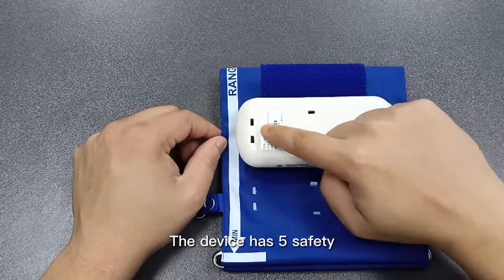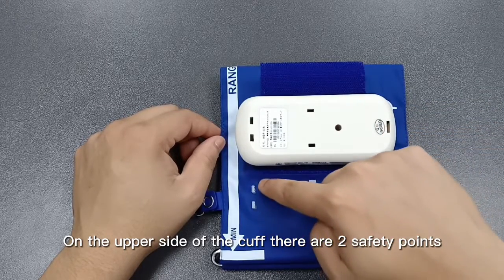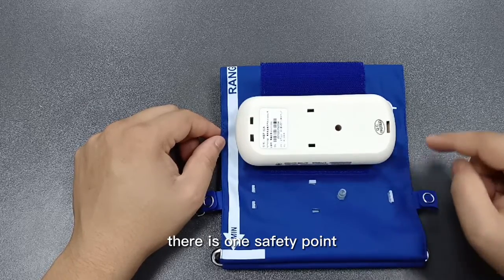The device has 5 safety points that help the monitor stay attached to the cuff. On the upper side of the cuff there are 2 safety points. On the middle of the cuff there are 2 safety points. And on the charging side of the cuff there is 1 safety point.